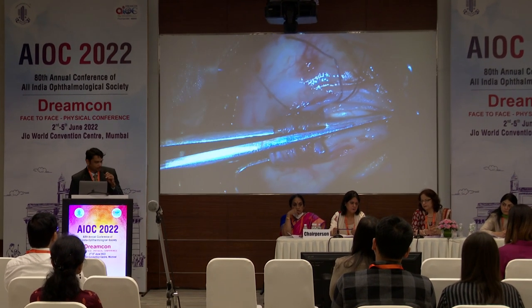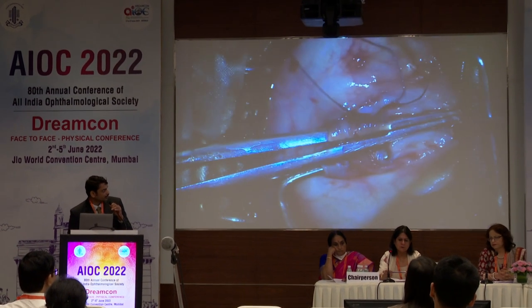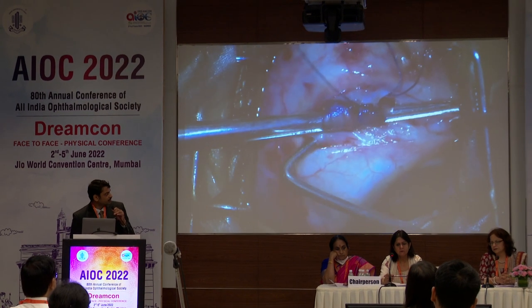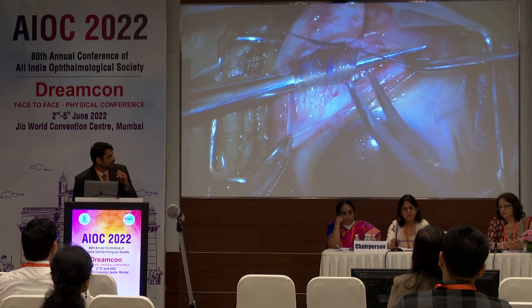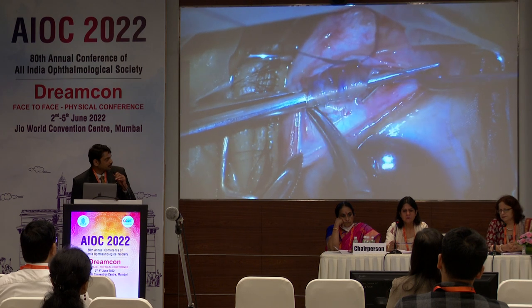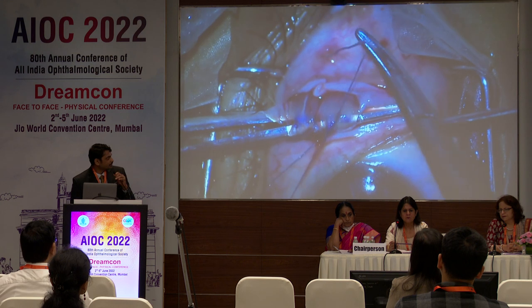So we have held the muscle with the forceps and we are slowly rolling it over. As you can see, since there is a gap, there is no crushing of the ciliary vessels. And we are only using a single forceps. After folding the muscle, then we are passing the 6-0 vicryl suture. As you can see, we have tied the suture.